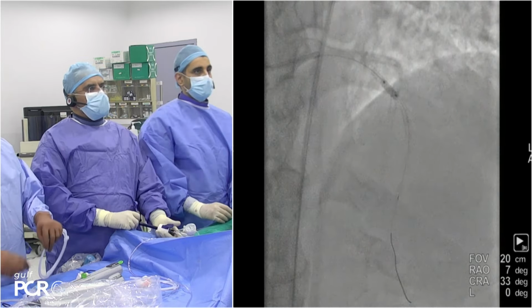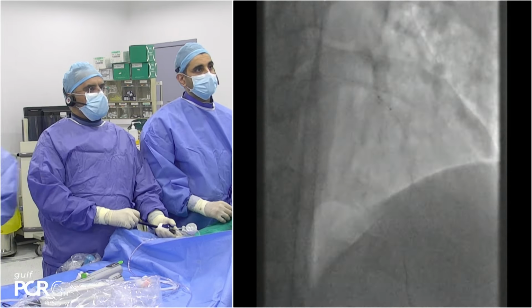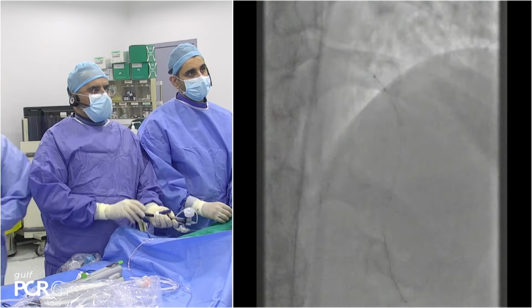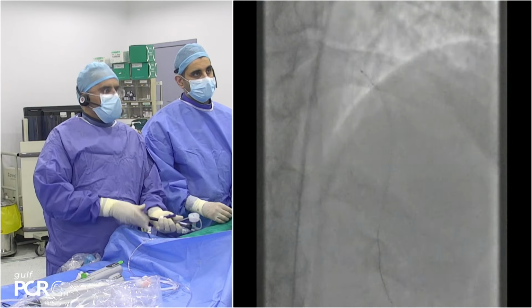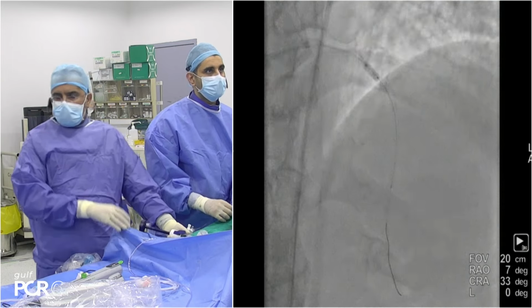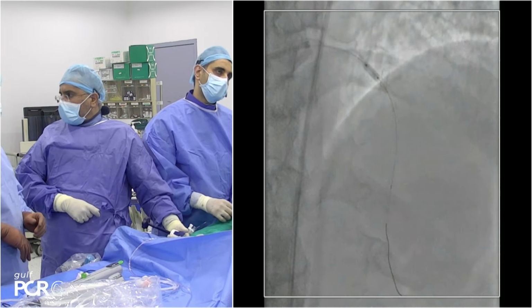Okay, approximately what size balloon is that? The size, yes. This is a 3.0 by 8. So to optimize the proximal part, we might need to go with a smaller one distally. Okay, let's do a stent viz, please. Let's have a 2.5 NC balloon.